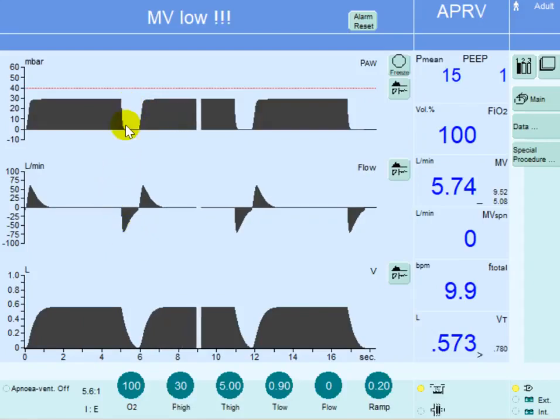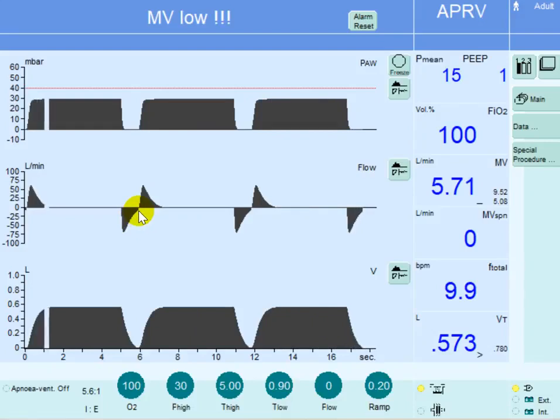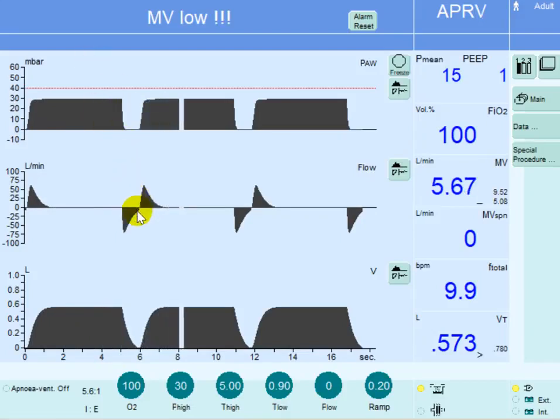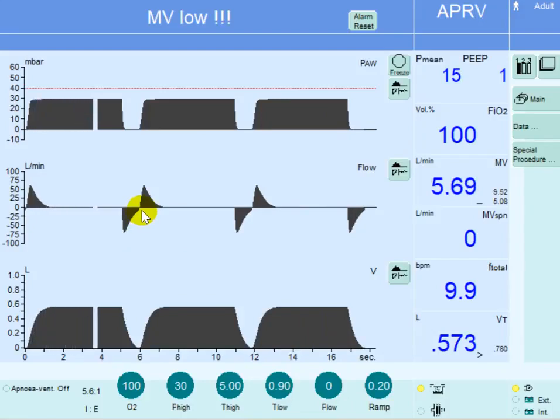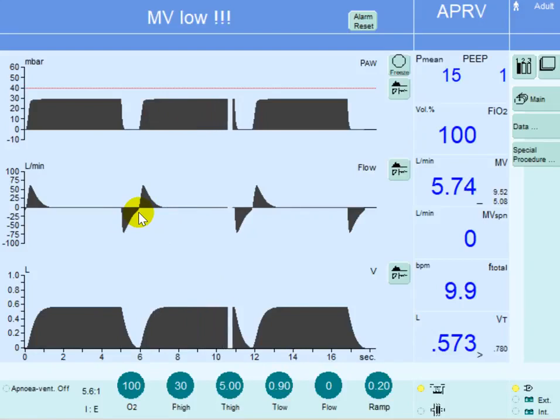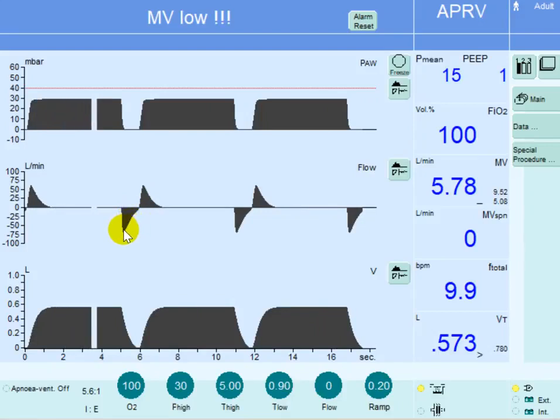Notice that every time the pressure is released, the flow goes to the peak expiratory flow and then decelerates. But in this patient the flow goes all the way to zero, meaning every time that pressure is released the patient is de-recruiting. There is no PEEP, so every time you release that pressure the flow goes to zero, emptying the lungs completely and leaving them de-recruited. This is a common mistake operators make.